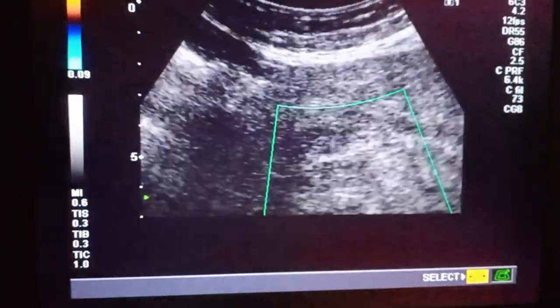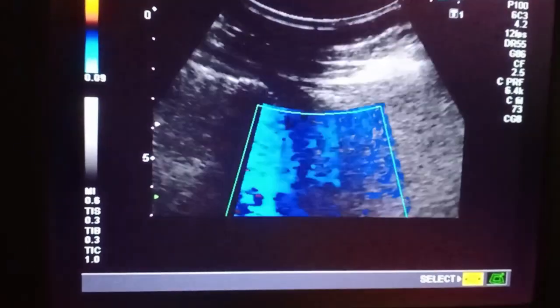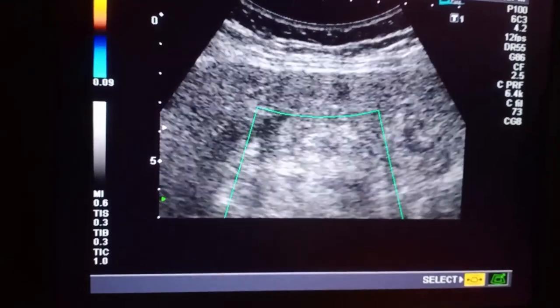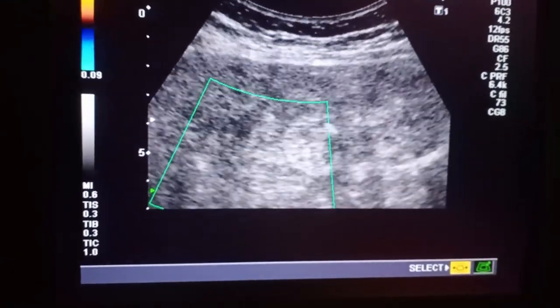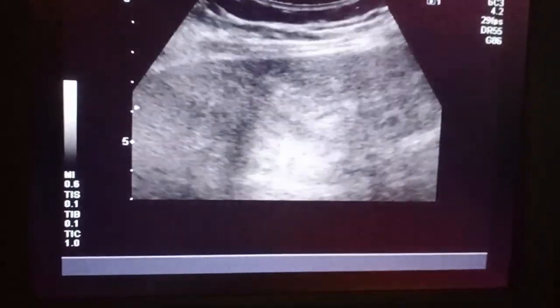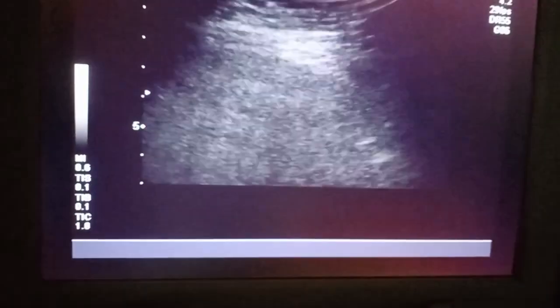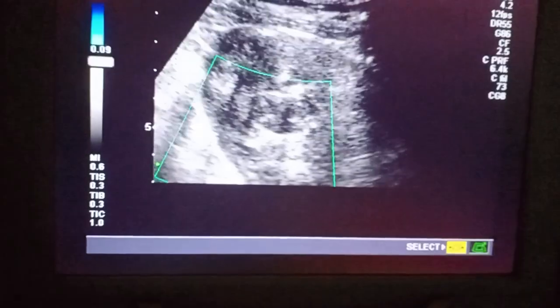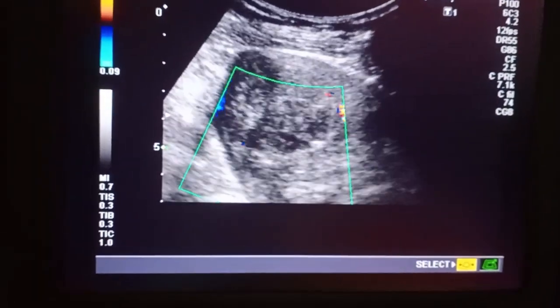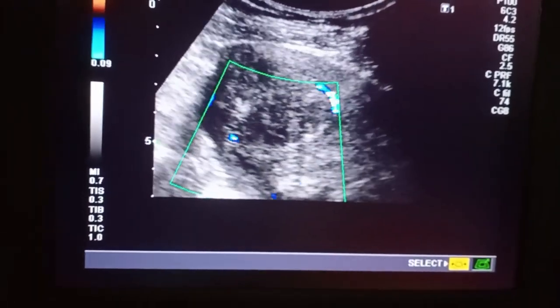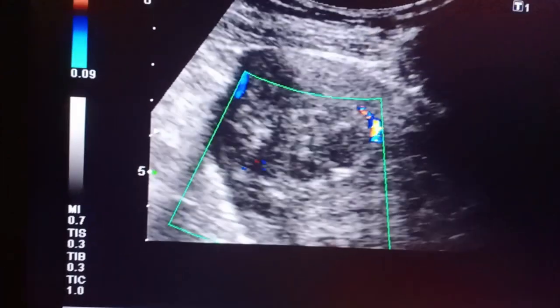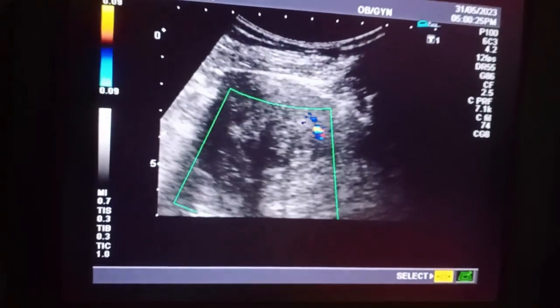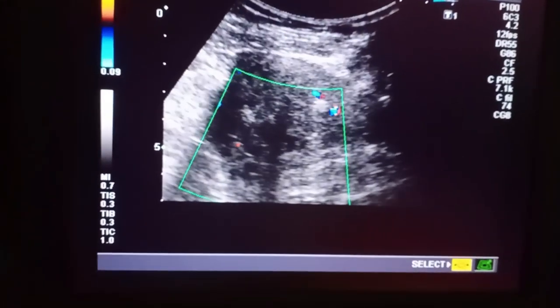We would like to rule out this mass on investigation such as biopsy or CT scan of the pelvis. Looking at the liver, I would like to focus on the kidneys on both sides to see the pressure effects of this mass. You can see the liver as well as the extension of the mass up into the epigastric region.